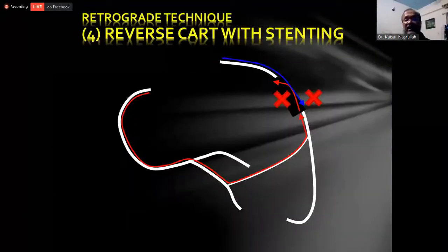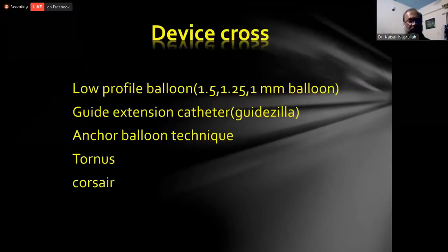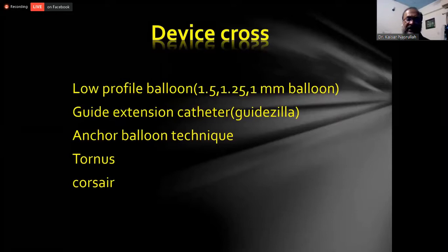There is another technique, reverse CART with stenting. And we should do all the device crossing things.